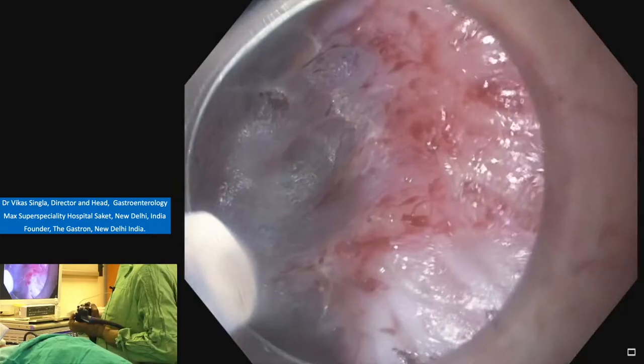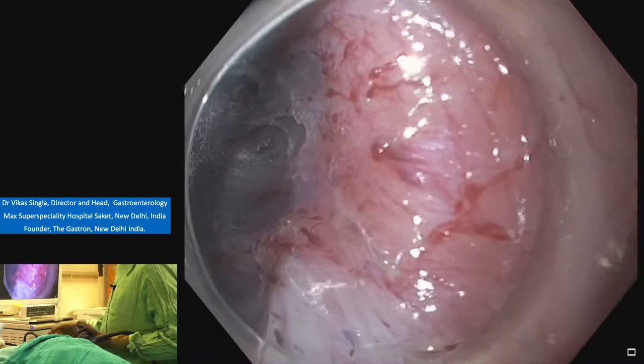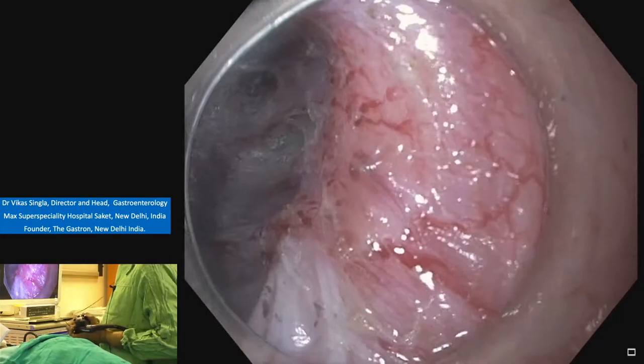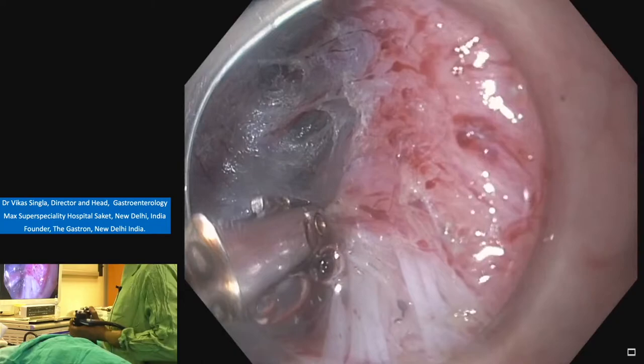Inject. So I will show you again. This is the narrowed area. It's the G junction. And then we have entered on the gastric side. I think we have entered the gastric side. Maybe 5 mm dissection more, and then we are done with the dissection part.